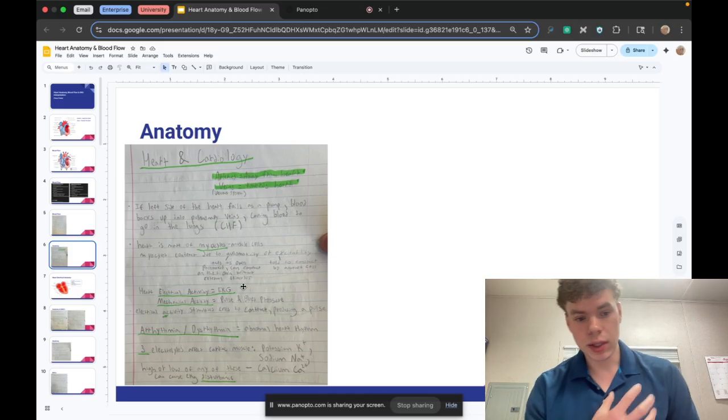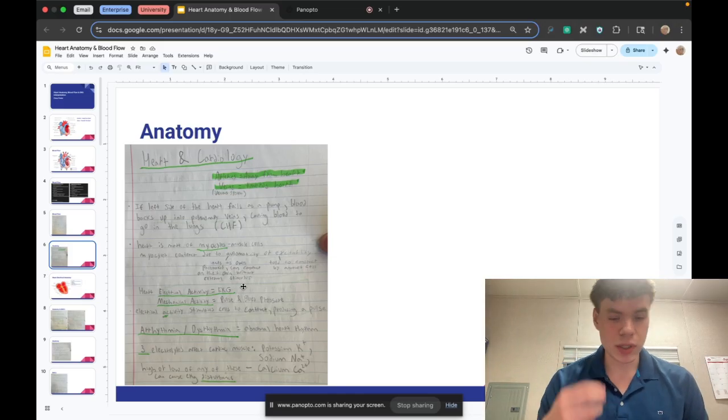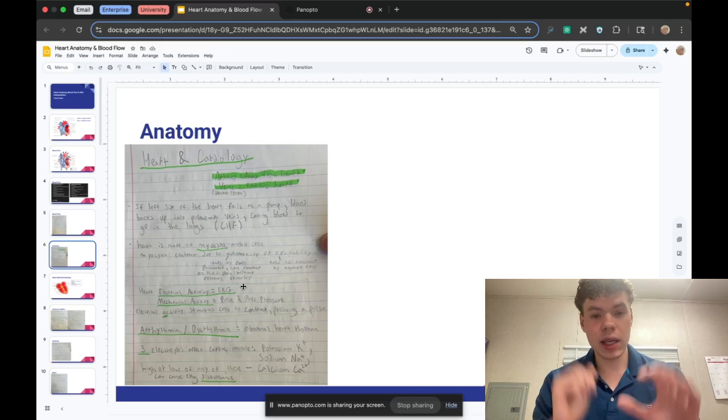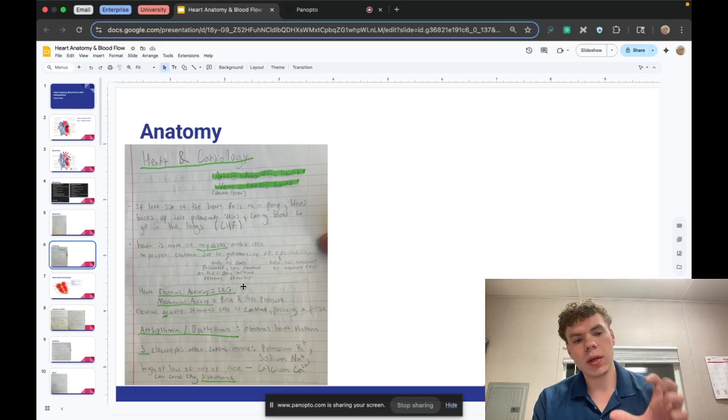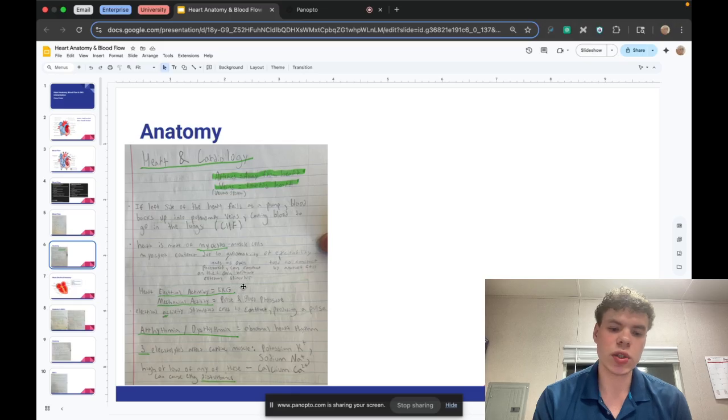You put the stickers on them, and there are specific ways that you place them. That EKG is going to take a picture of the heart, and that picture is going to give you a rhythm. There's also a 12 lead EKG, where you take 12 views of the heart. But basically, an EKG is measuring the electrical activity of the heart and what is happening inside of it.